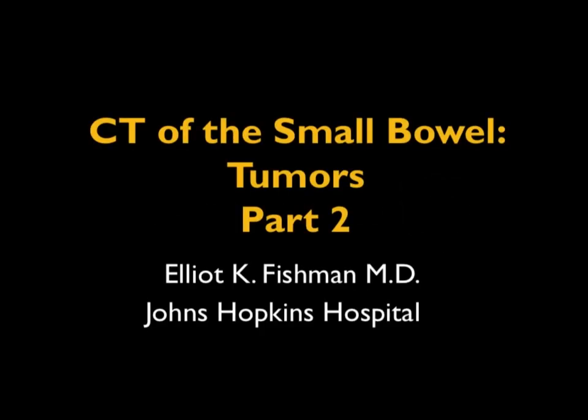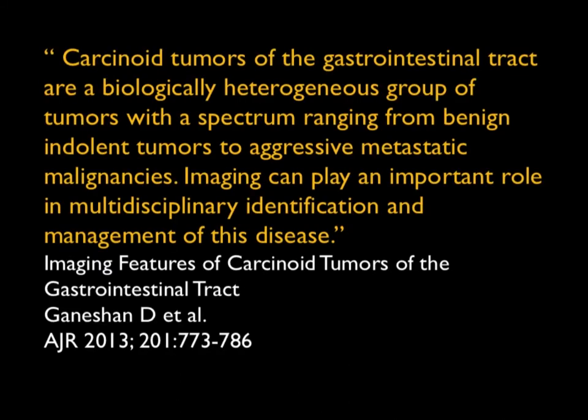Hi, this is Elliot Fishman, and welcome back to part 2 of small bowel tumors. We spoke about adenocarcinomas, and now let's look at carcinoid tumors.